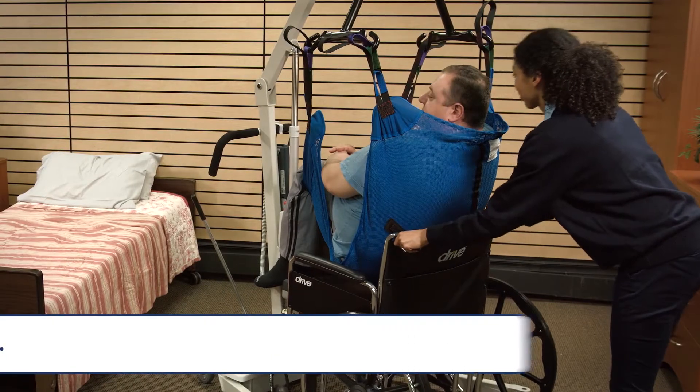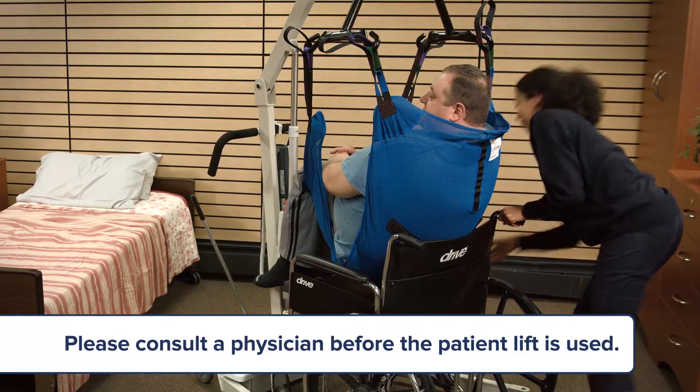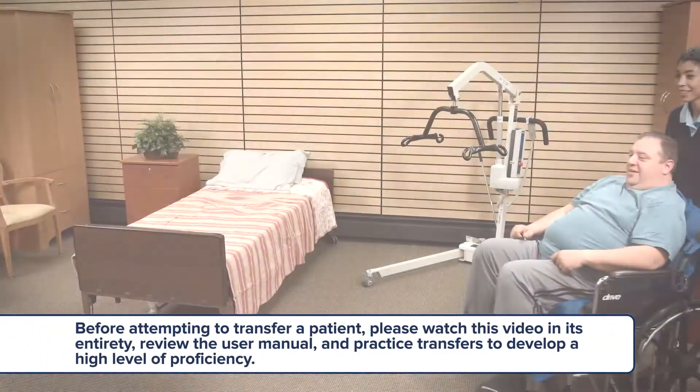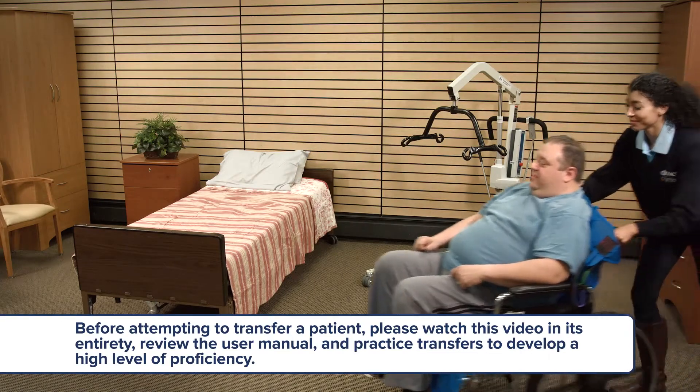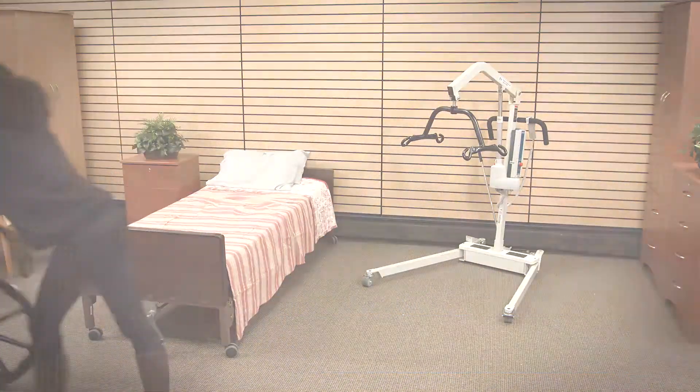Safety is most important when using a patient lift — your safety as well as the patient's safety. Keep your back straight and in a neutral alignment. Do not twist your back when lifting. Keep your center of gravity stable and low, and use your leg muscles.